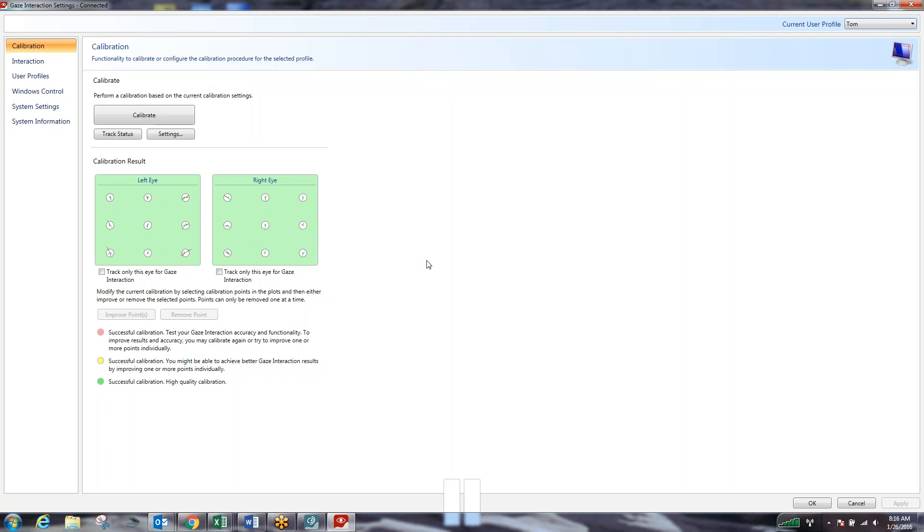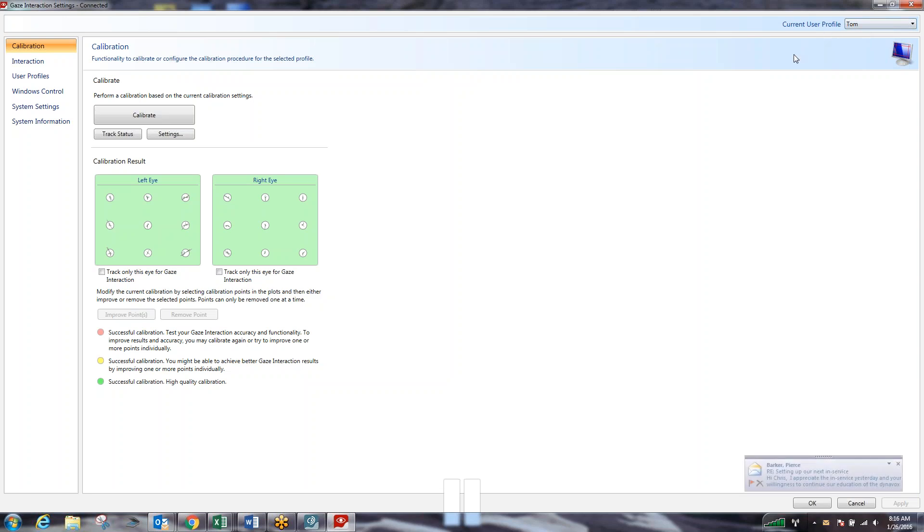It's going to give me a little bit more of an in-depth option for my calibration. So at this point, since we set up a profile, you'll see that it currently loads me onto my profile of Tom, which is great because if we need to change profiles later on, we can set up different calibrations for different user profiles within the system.